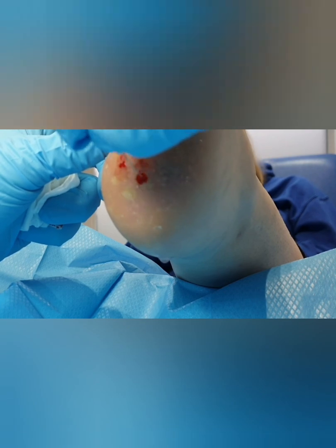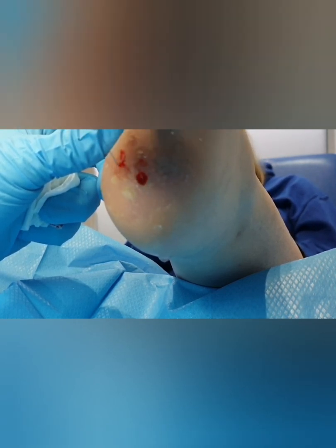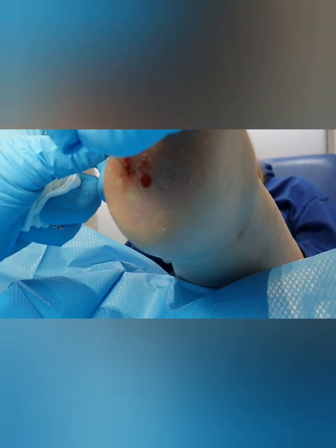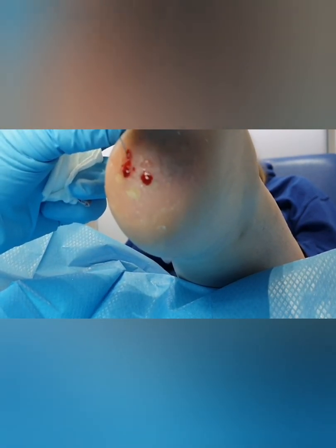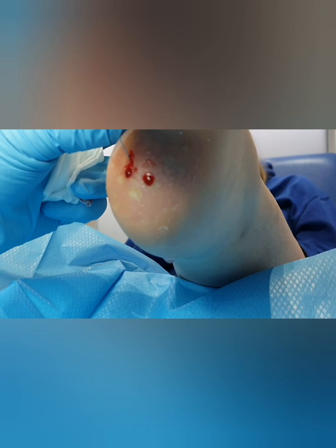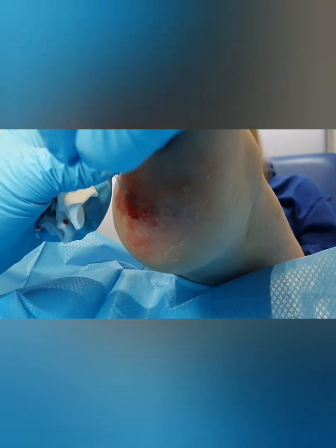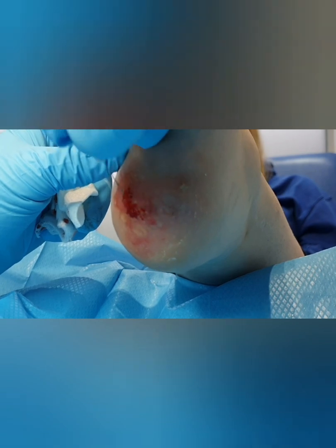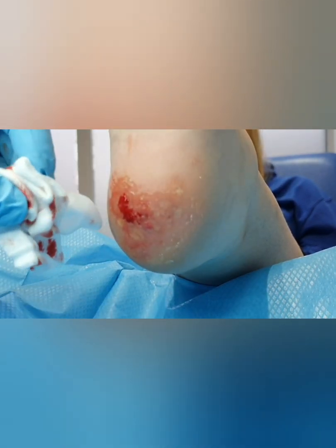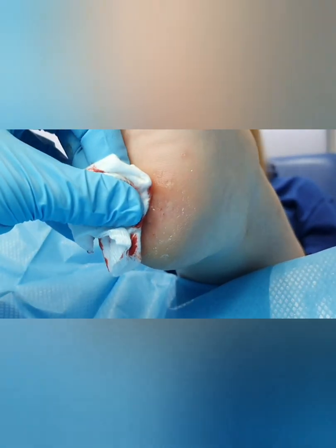So this is the gory bit. Essentially with needling, verruca needling, also known as Falknor's needling, we are inserting a needle hundreds and hundreds of times into the verrucas. Like I say, we have to do this while the tissue is numb, because there's no way you'd stand this otherwise. We pass the needle lots and lots of times into the tissue, and the idea is that by doing this, we are trying to expose the virus to the immune system, the bigger, beefier immune system.